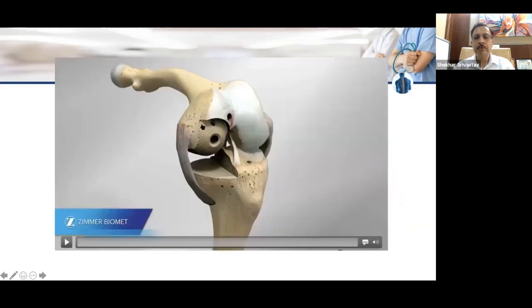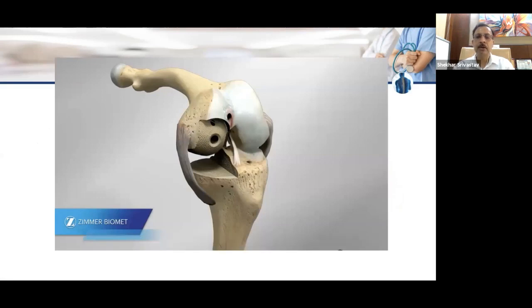So till now we have understood what we have done. We have taken the tibial cut. We did first initial milling with a 0 spigot. Then we checked the balancing in extension and flexion. Now we found out the difference in the space in extension and flexion, and then we milled it further so that both the extension and the flexion gap is balanced.